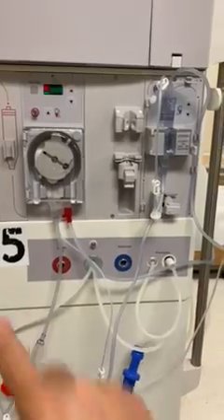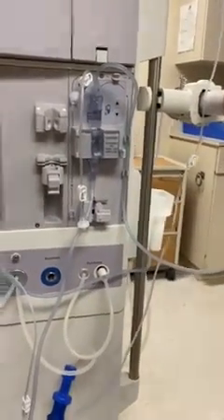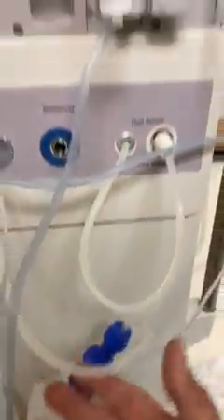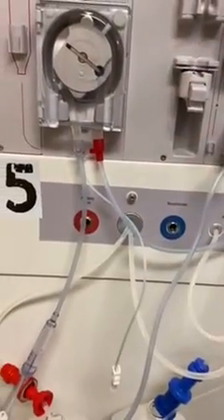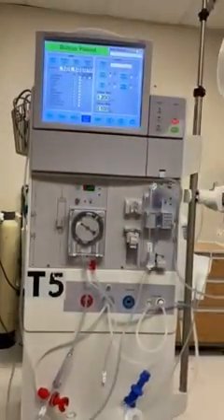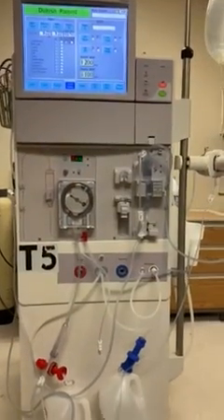So once we get it through the blood pump, it goes through the venous chamber, hooks to our dialyzer. Air is our enemy. We don't want air in here. If for some reason I let this bicarb go dry and air gets into the system, rinse the machine. That will be the best thing possible for you, because in the long run, whether you have it or the next person has it, you will have problems running this machine.